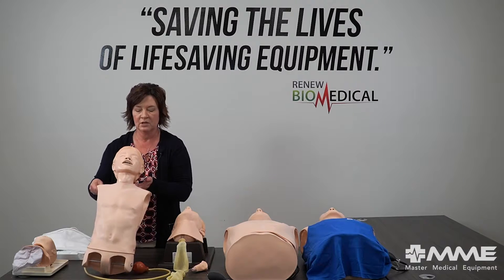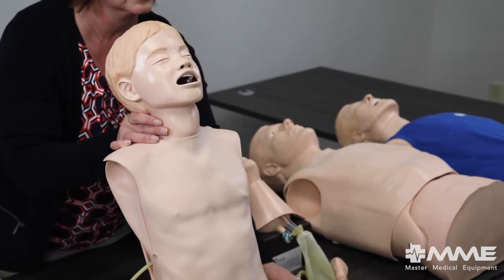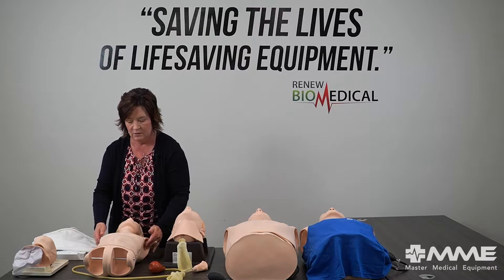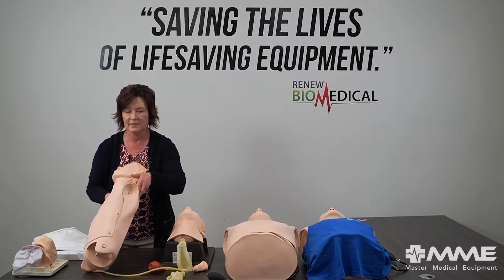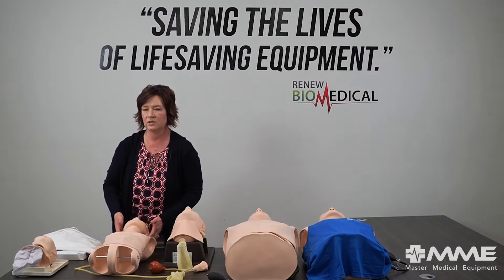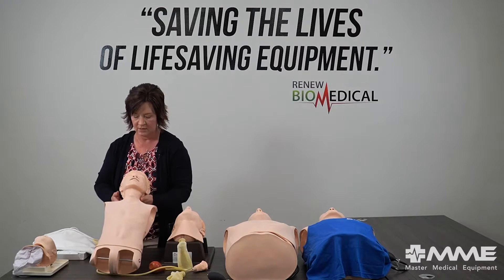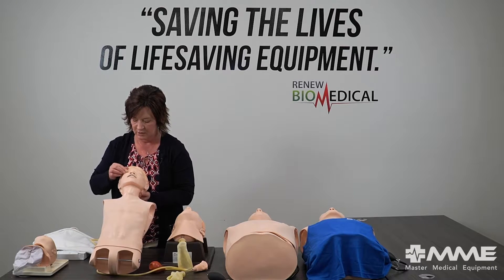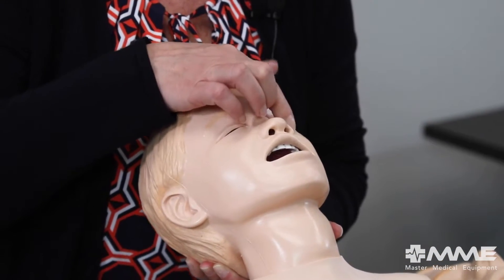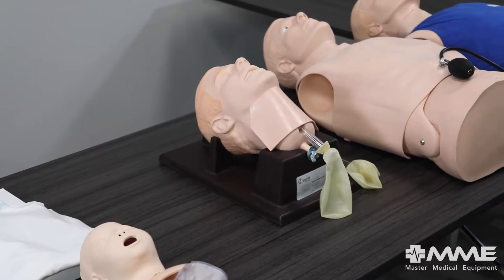We're going to move on to our pediatric airway management task trainer. You can see this bulb that actually provides carotid pulses. You can do chest compressions on him — again, no feedback, but you can perform the compressions. He has bars and holes in the arm sockets, so if this year you have money for the task trainer, next year you can look at adding legs, arms, IV arms, or a leg that does IO. He also has interchangeable eyes so you can check pupil size as part of your scenario.